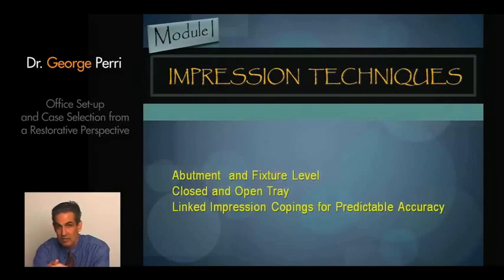I think one of the biggest mistakes that's occurred in implant dentistry over the last few years is an attempt to, what I call, dumb down implant dentistry to the point that it's so simple anybody can do it without thinking. Well, the problem with that is that we end up with inaccurate impressions that potentiate inaccurate master models. We make frameworks and even individual crowns that don't fit the same on the model as in the mouth. As restorative dentists, we have that uncomfortable feeling of trying to make something fit or work. We adjust restorations for hours, trying to get them seated. It is an uncomfortable situation, and we start to dread it.